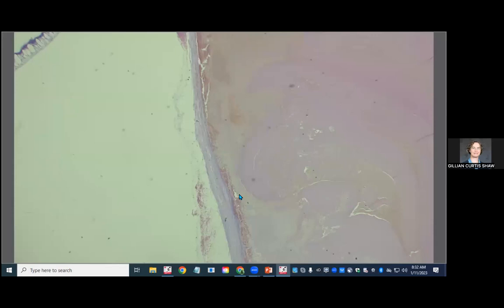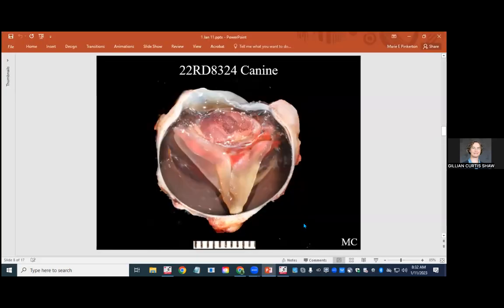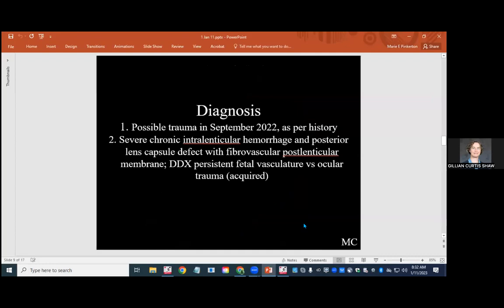So long story short, top differentials in this case: trauma or congenital malformation of the lens and persistent fetal vasculature. And it's kind of impossible to be sure or to tell histologically at this stage of disease. So here's that in writing. There you go. And drips and drabs of other things, as Kelsey would say, but these are the main diagnoses that we would have.